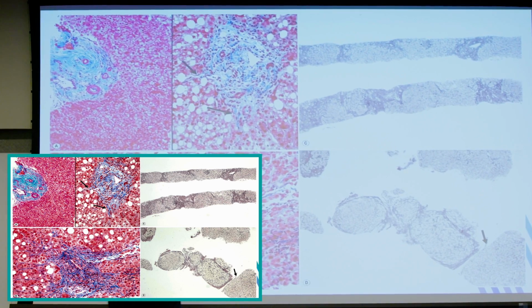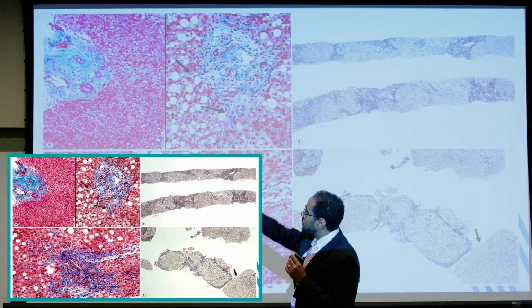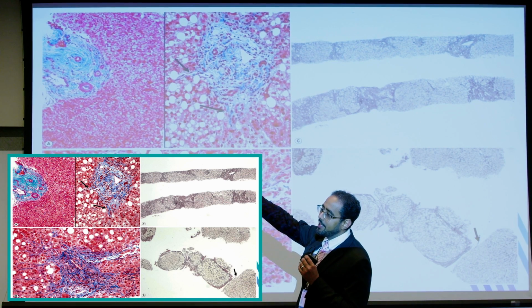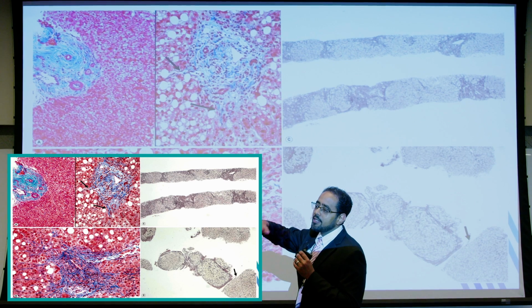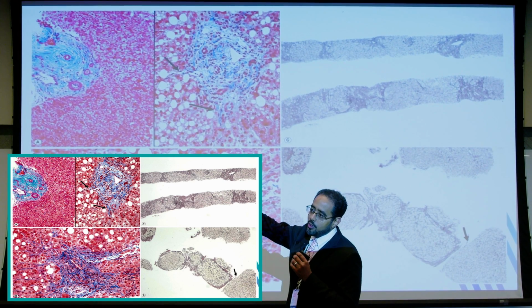So this is what we call the trichrome stain. It stains the fibrosis as blue. So that's all scar tissue or fibrous tissue in that portal tract where the inflammation happened. Now it's healing up. So this is the very low grade on the staging, the first step, fibrosis. It's very round and nice, but it's only limited to the portal tract.